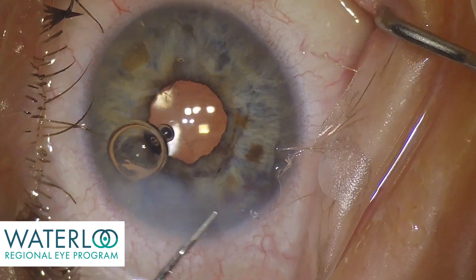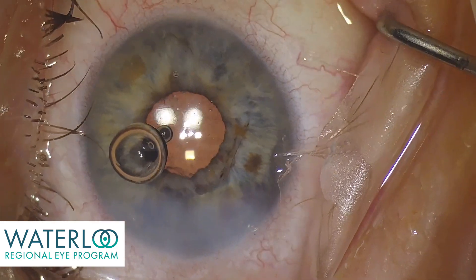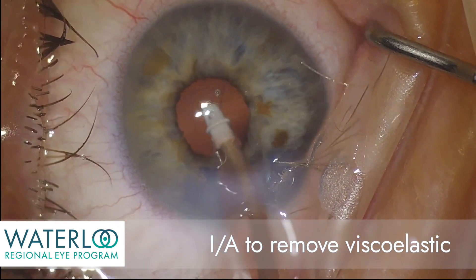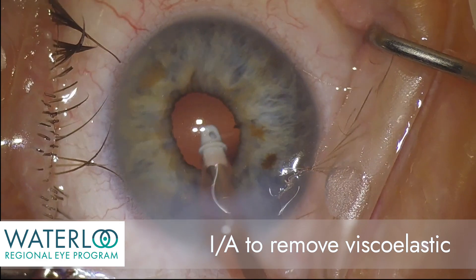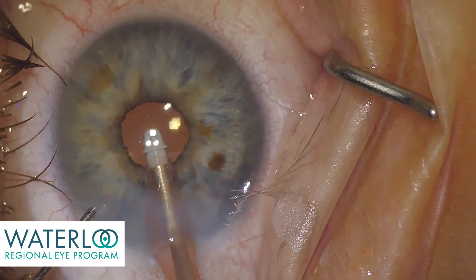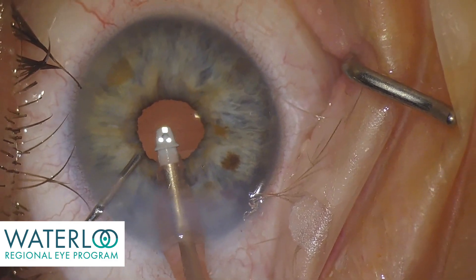The main incision is hydrated. Irrigation and aspiration is used to remove the remaining viscoelastic, and you can see here the undulating iris from the turbulence of the fluid because of intraoperative floppy iris syndrome.